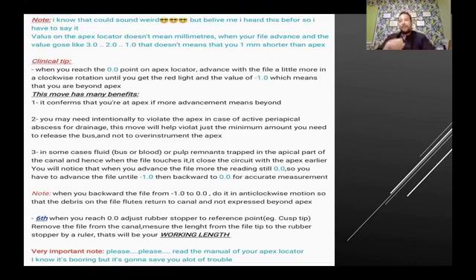Another thing that's very tricky, and happens a lot with me, is that sometimes there's a drop of water. The canal is empty, you empty the canal from water, and just a small drop of water remains in the apex. When the file touches the drop, it will give you 0.0, but you're not at the apex, because the circuit is closed with this drop of water.